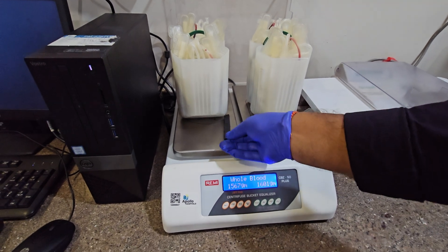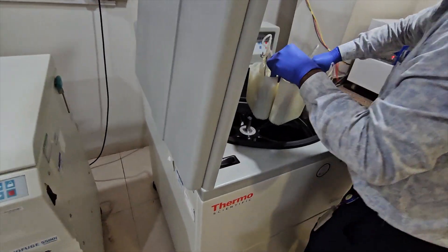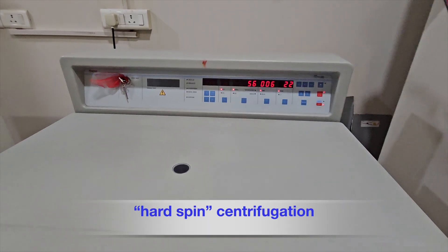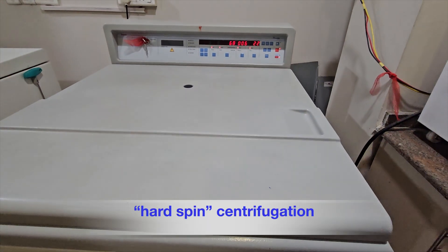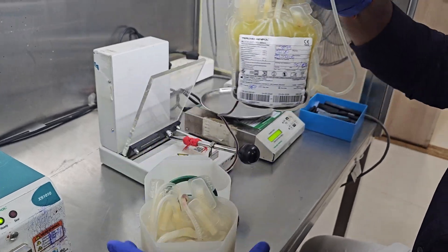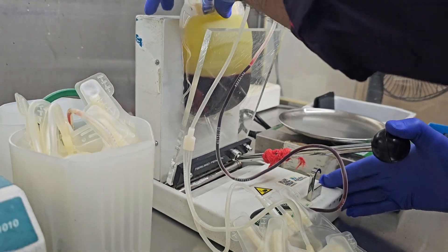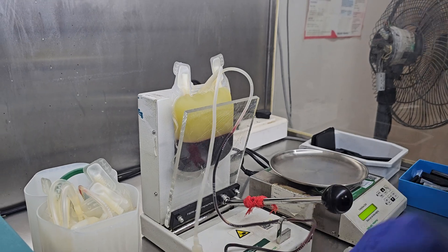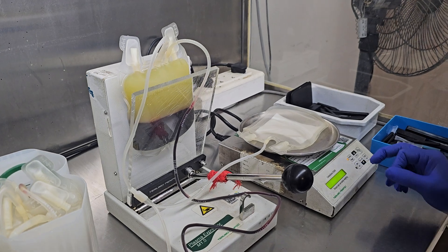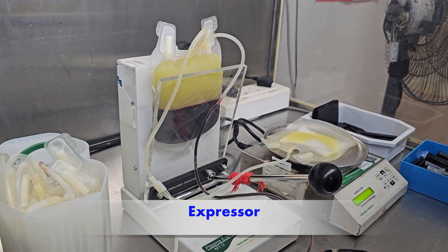Bags are tied and put inside the centrifuge bucket, then the blood is put into hard spin centrifugation. Bags are removed and placed on the expressor, which squeezes the bag and thus separates platelet-rich plasma from red blood cells.